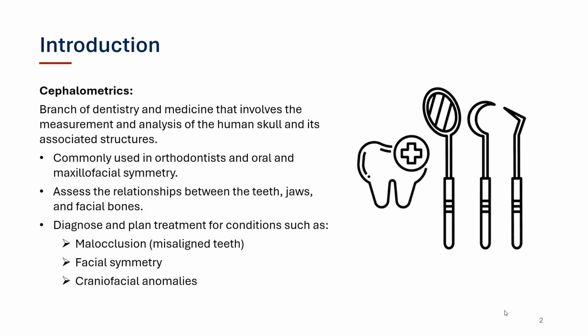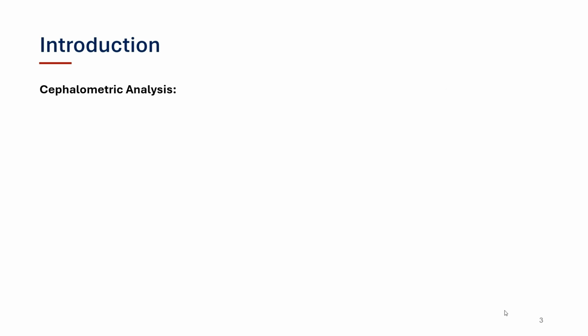Starting with the introduction, cephalometrics is basically a branch of dentistry and medicine, which is commonly used by orthodontists to analyze the relationships in the human skull. It is used to diagnose cases such as malocclusion, which is misaligned teeth, facial abnormalities, and even for aesthetic purposes.